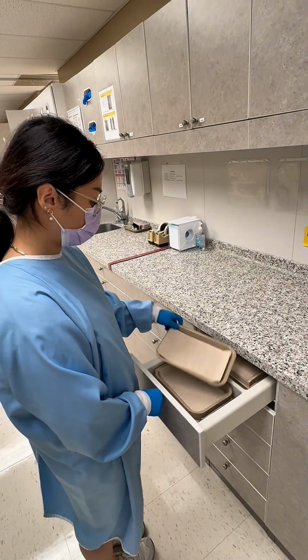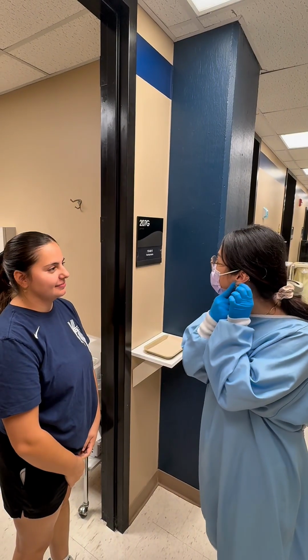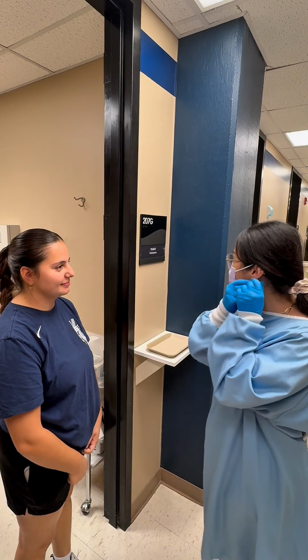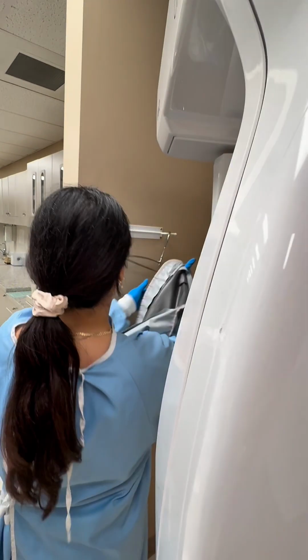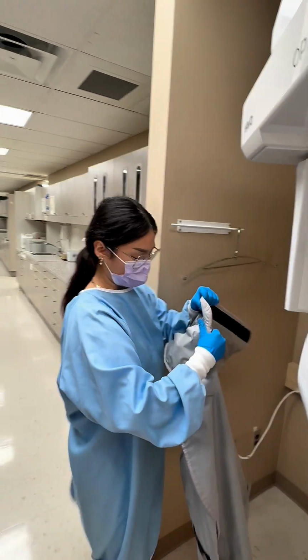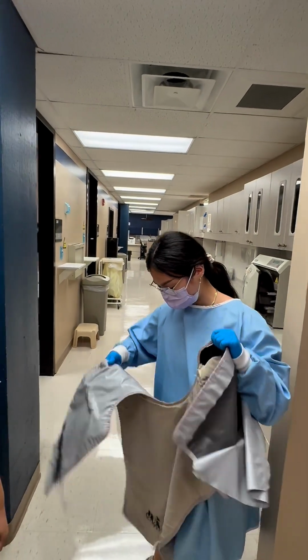Obtain either a tray or a cup from the clinic, then ask the patient to remove any personal items, any metal objects, and place them on the tray or in the cup. Next, if the patient has signed consent for it, place a lead apron on the patient with the front side open.